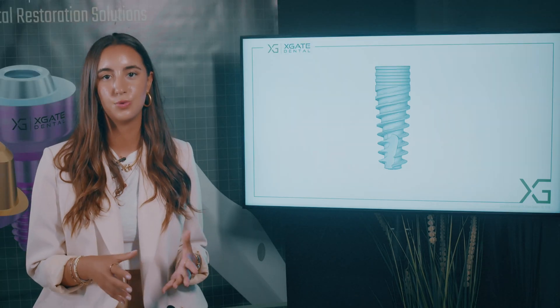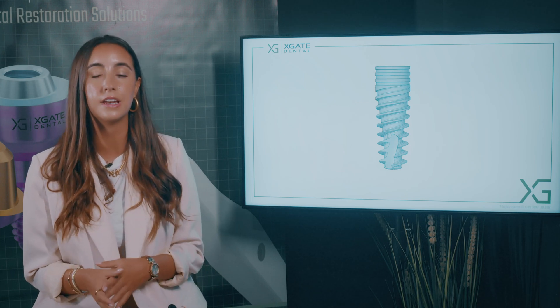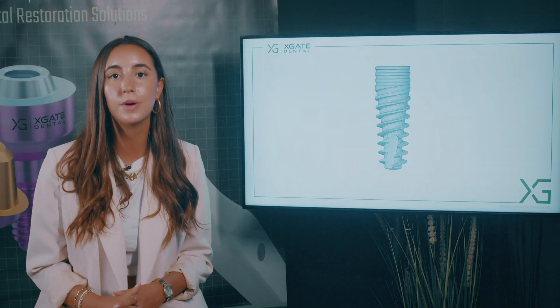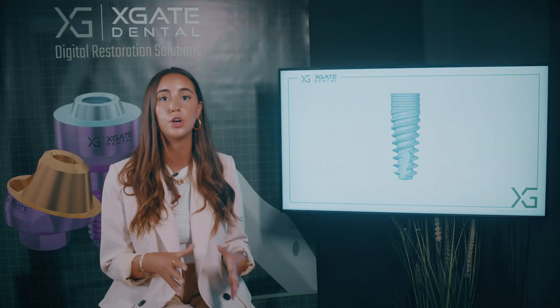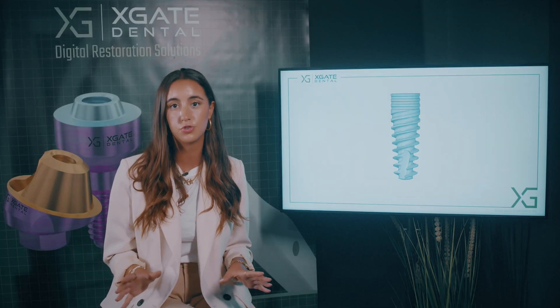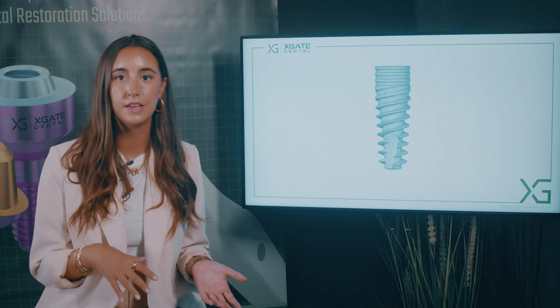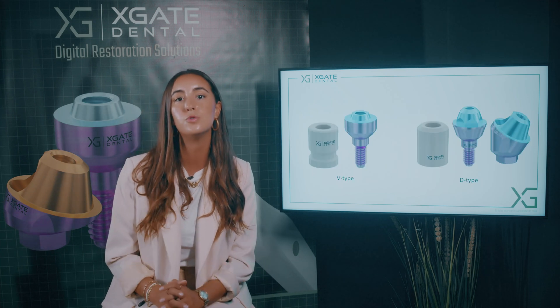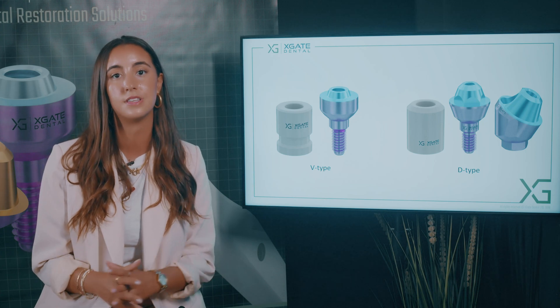When you have a missing tooth and the space between the adjacent teeth, you place an implant and you need to wait about three or four months for the implant to heal itself in the bone. In three to four months, the bone will become one with the implant. After this period of time, you can open the implant and insert all the substructures you need to replace the crown. You close the implant, then open it and place different structures inside to build the future crown or restoration that will replace the missing tooth.